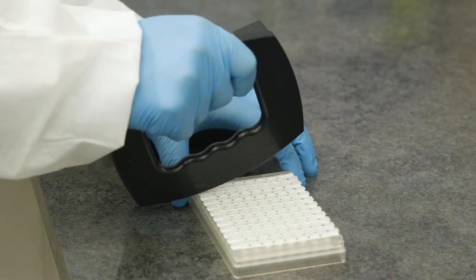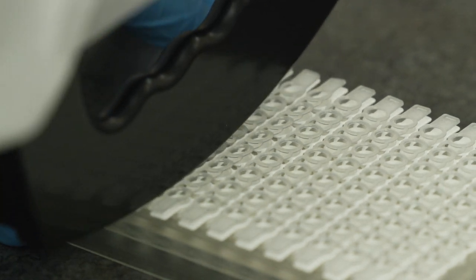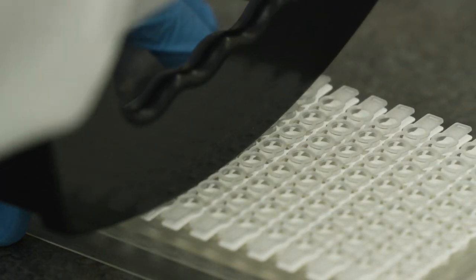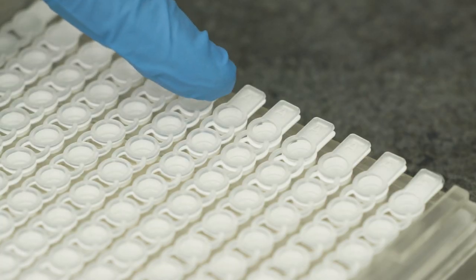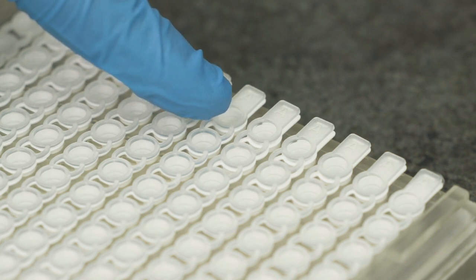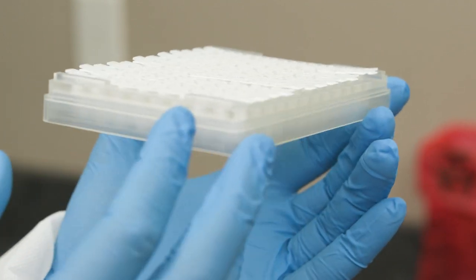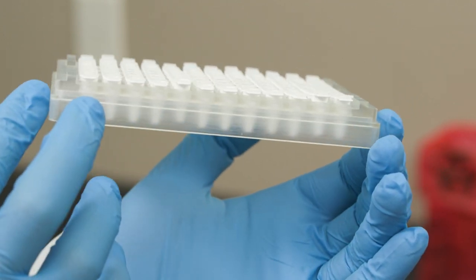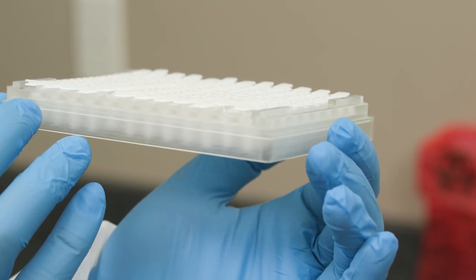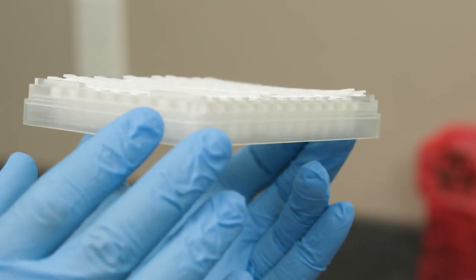Apply pressure on the caps with the GeneUp capper tool. Ensure that the edge of the capper tool is over the tubes. Improper alignment of the capper tool over the caps will not properly seal the caps on the tubes. The tubes are now ready to be used for a self-test analysis. Note, when not in use, the self-test tubes can be stored in a plastic bag or container.